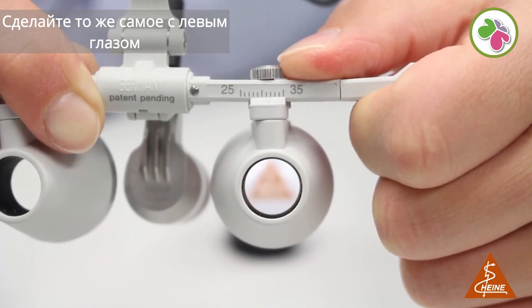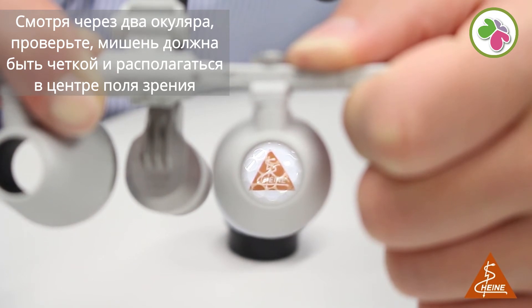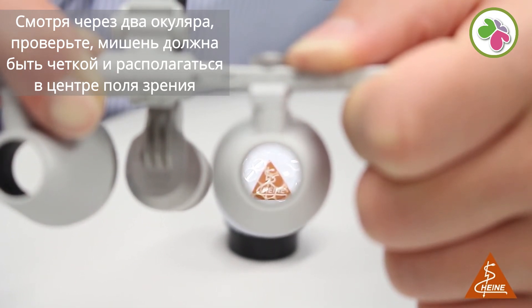Do the same procedure with your left eye. Then check if the target appears as a sharp image in the center of your field of view while using both eyes.